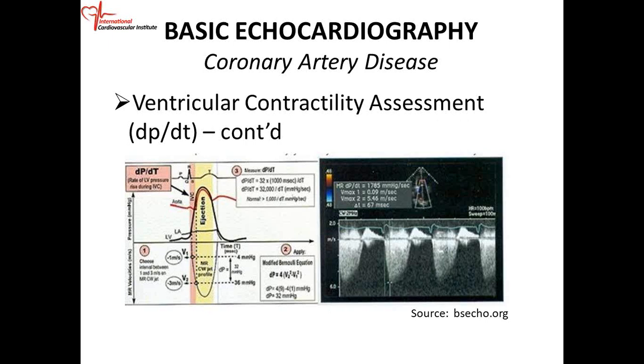You want to look at the IVCT period, and that is why we use the 1 meter and 3 meters per second. This occurs in the IVCT period. All right. So again, on the machine at 1 meter per second, you come across where it intersects the graph.